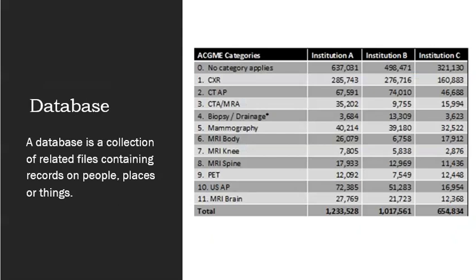When we talk about a database in terms of business analytics, we're talking about data sets and tables being stored in a database format. There are many database formats and models. Do not confuse this concept with the database server that is part of the PACS network architecture. While it's true the database server stores all the information in PACS, usually in a SQL database, it's not the only database that you will work with.